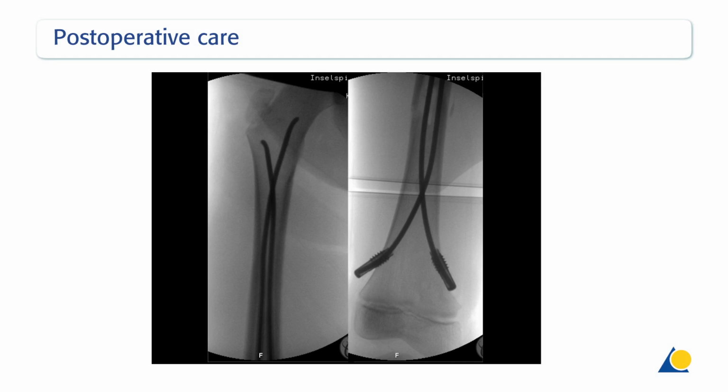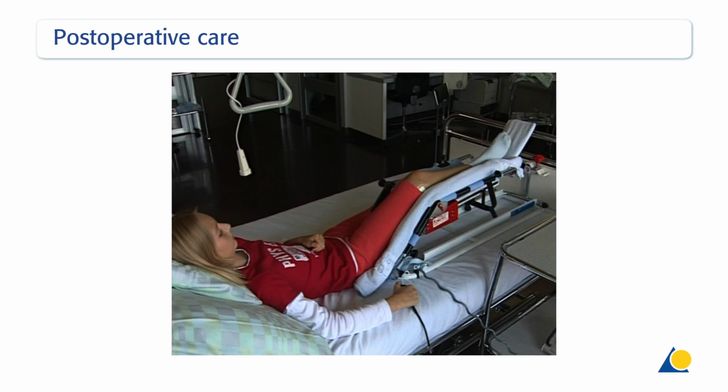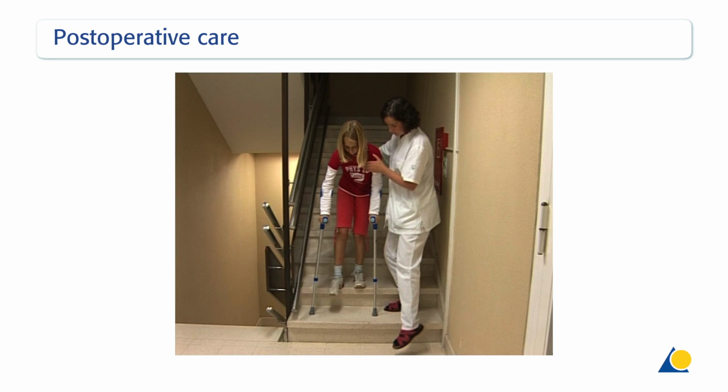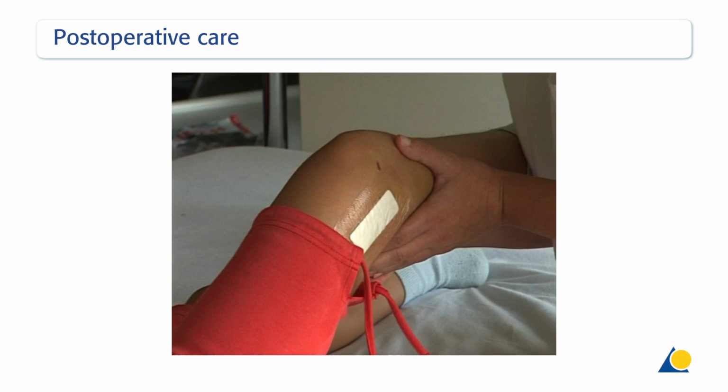Postoperative X-rays should show an anatomical reduction that would be expected in a child. The nails should be positioned correctly with good distal and proximal anchorage. Depending on the age of the child, immediate passive motion by a physiotherapist or continuous passive motion (CPM) should be started on the first day after the operation. On the second day, mobilization on crutches with toe contact may be possible depending on the pain. The patient is usually discharged after 3 to 5 days.